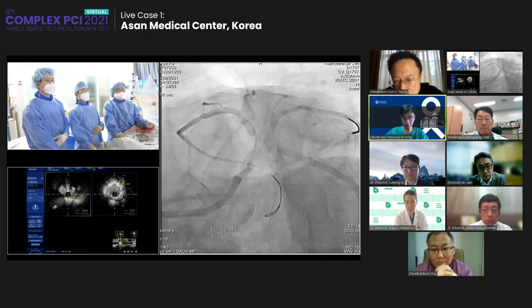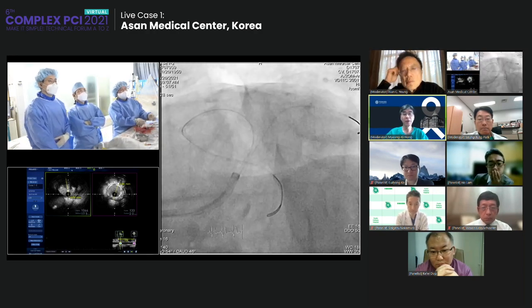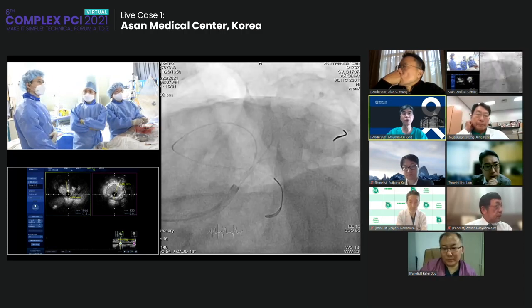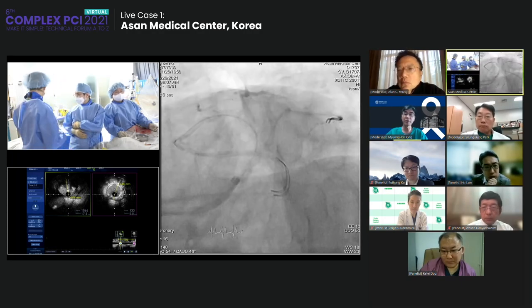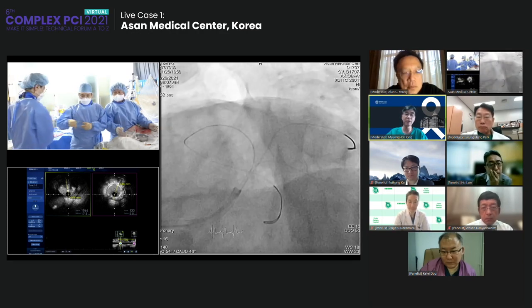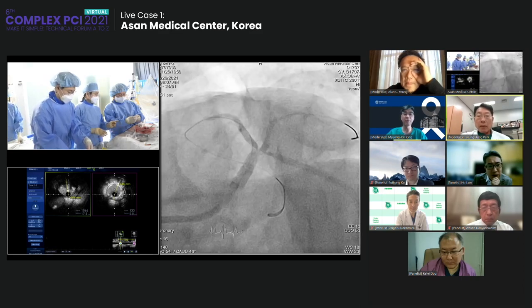In this case, yes, it shows us the real value of the imaging. What I mean is that if we do not use the intracoronary imaging, maybe some interventionists would try to fix the ostium of the big obtuse marginal branch with a stent or a re-stent. That would mean stent in the circumflex ostium or additionally the obtuse marginal branch and the LAD, which would cause crowding of the stent struts near the left main bifurcation.